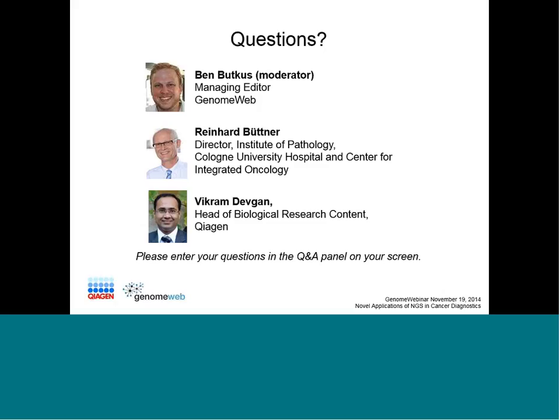Can I add one sentence to this? Please go ahead. If you see that you lose, for example, through the purification step, a lot of DNA, probably the most likely reason is there's a lot of degradation. The typical reason is overfixation or heavy underfixation, and the tumor is not fixed well and it degrades because all the enzymes still work. And then you, as a pathologist, should talk to the primary people that handle the tissue. I think you need to improve the tissue fixation. That's a very important step.